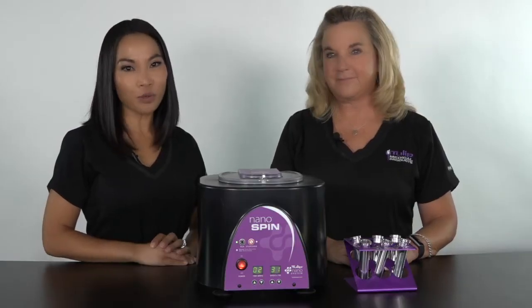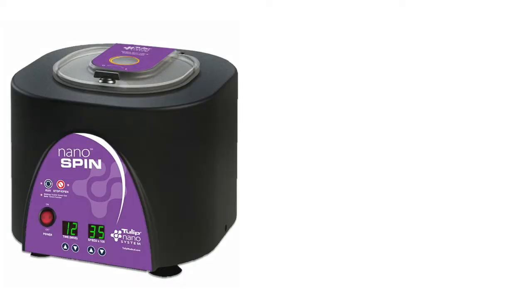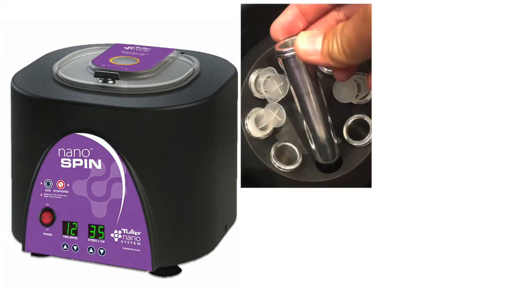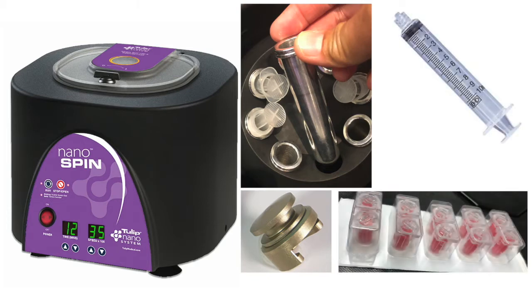First, I'm going to show you what comes in the Tulip Nano Spin Crown System. It comes with a centrifuge, eight sleeves, eight Tulip patented crowns, your 10cc BD syringes, as well as your centrifuge caps.